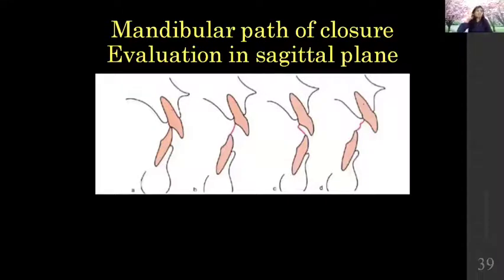That has to be judged properly in order to diagnose or to predict the prognosis of your myofunctional appliance. First of all, when you're checking, you might encounter a rotational movement, that is, there is no anterior or posterior gliding. At the end, when the incisors touch, the cingulum of your lower incisor is going to touch the cingulum of your upper incisor. In such cases, it is pure rotational movement. Prognosis is going to be excellent in such a class 2 division 1 malocclusion.